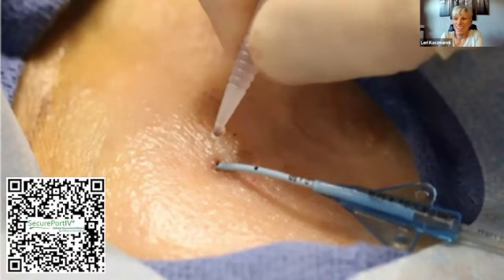This says, what topical thrombins are indicated for use on vascular insertion sites? Well, again, there's several products, powders or discs that can be used. I would talk first with your hospital's management or your organization system, with your policy and procedure. But you've got the Stat Seal, which comes in a powder or a disc. It looks similar to a CHG disc that you're putting around the catheter, applying some pressure. The powder one looks more like a round disc that you're placing the powder into that little round circle. So it achieves that thrombin around that catheter and site to seal that bleeding and oozing.